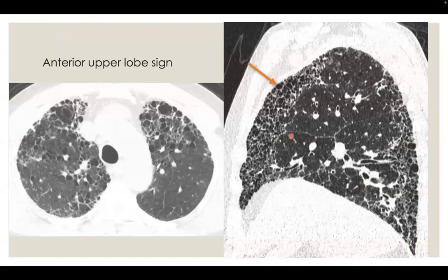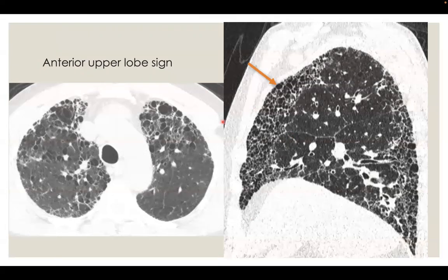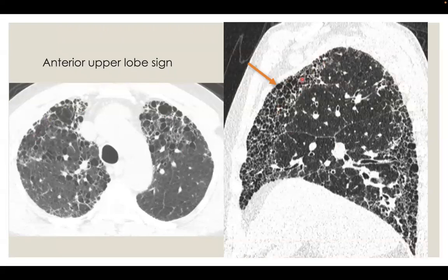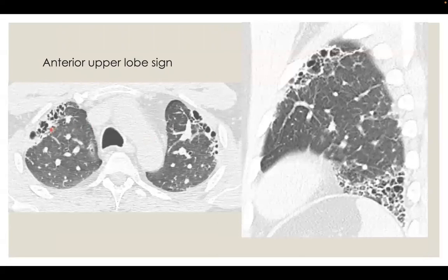Features that suggest a typical UIP pattern is secondary to connective tissue disease — we have four signs. First, the anterior upper lobe sign: honeycombing is present anteriorly in the upper lobes, as seen in this axial cut and confirmed in the sagittal view showing honeycombing in the anterior portion of the upper lobes. This is called the anterior upper lobe sign. Here is another example showing the anterior upper lobe sign.